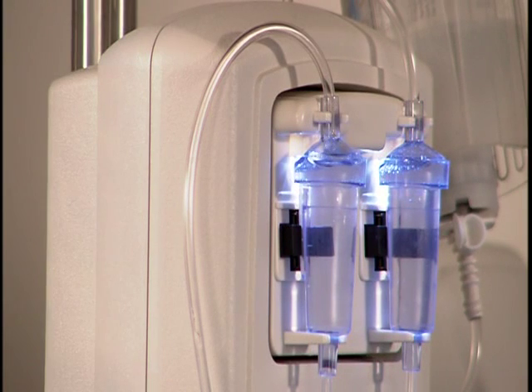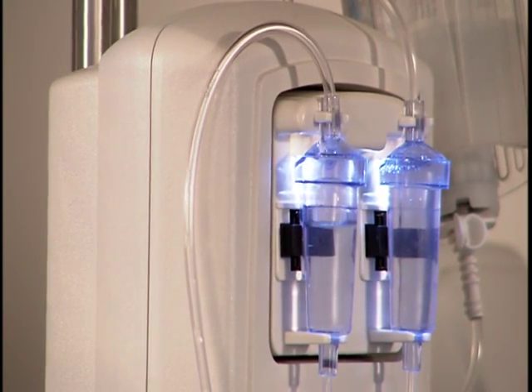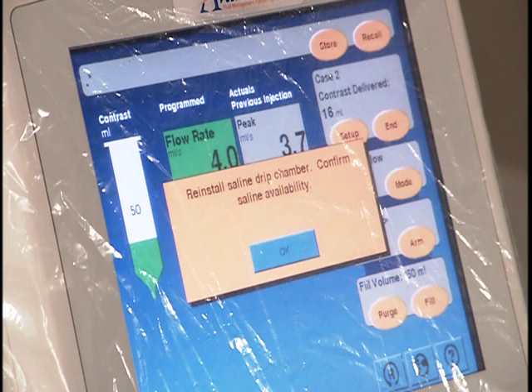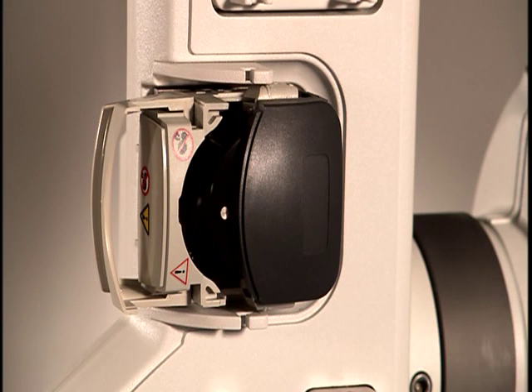Fluid level sensors detect the absence of fluid in both the contrast and saline drip chambers. Lighting behind the drip chambers flashes when there is insufficient fluid. This safety feature helps minimize air entering the system by alerting the operator. The peristaltic pump delivers saline for flushing during imaging procedures.